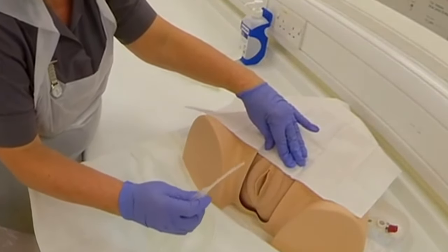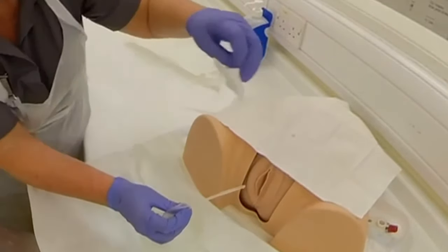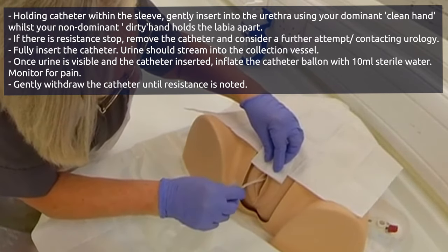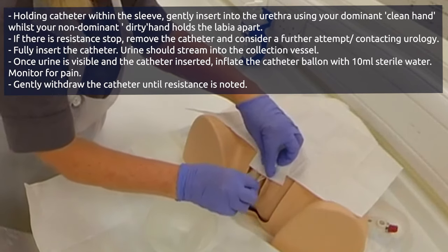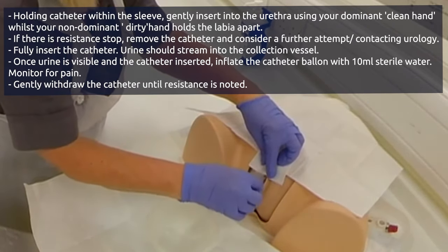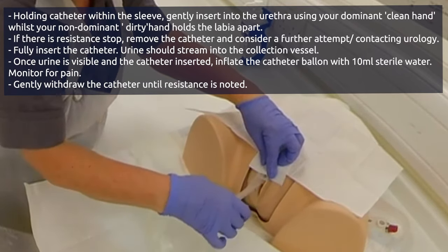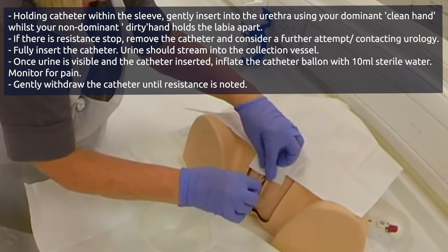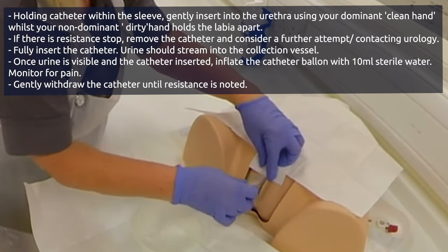Now that's worked. I'm now going to insert the catheter, which might be a bit tricky, but we'll have a go. You tell me if it's okay and not too uncomfortable. I'm going to push that in. Good. Doing really well, thank you. I'm going to pop this in all the way up to the top.